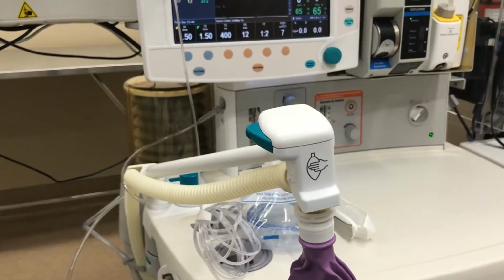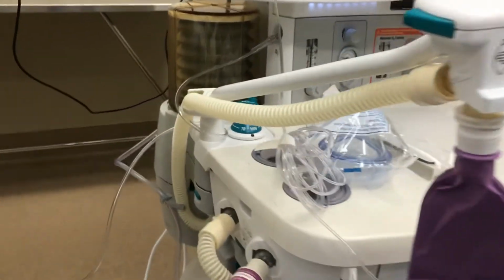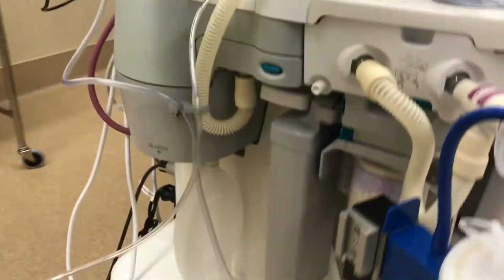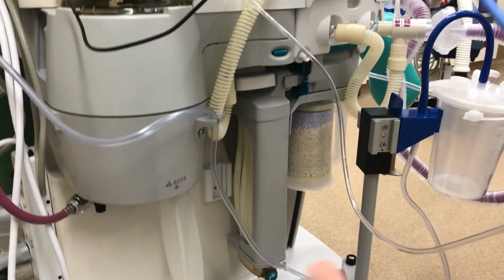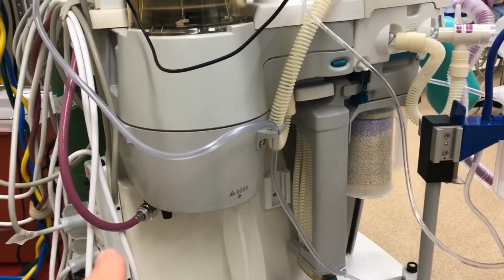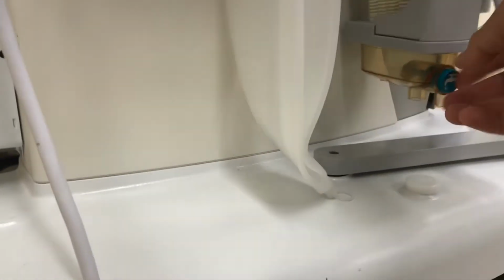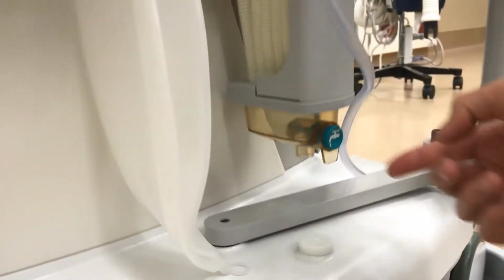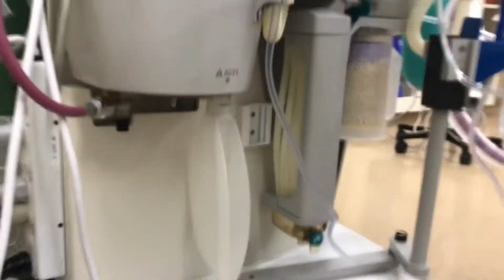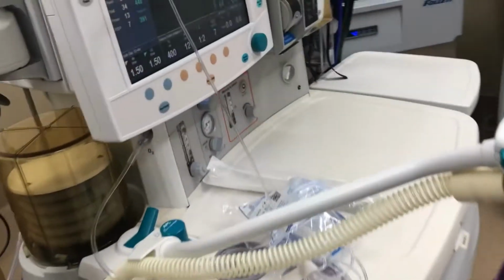Now, every time the bellows hit the top, we still have fresh gas coming in, and that extra gas goes out what's called the scavenging system, which is another difference from a standard ventilator. This is the scavenging system, which excess gas goes out into this purple hose, which goes into specialized suction. There is the ability to drain any condensation that accumulates down here as well, and that allows us to keep the system as clean and dry as possible.